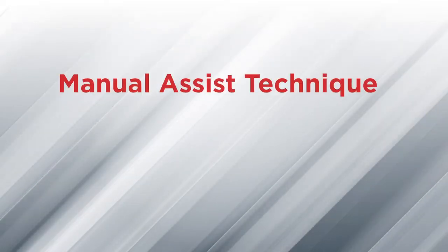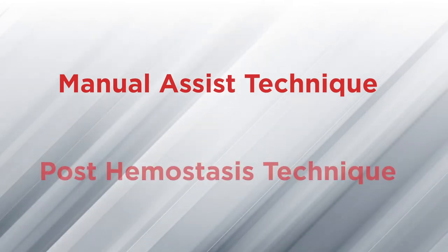The Safeguard device may be used to achieve hemostasis using either the manual assist technique, or to control oozing using the post hemostasis technique. We will now review placement and inflation for each technique.